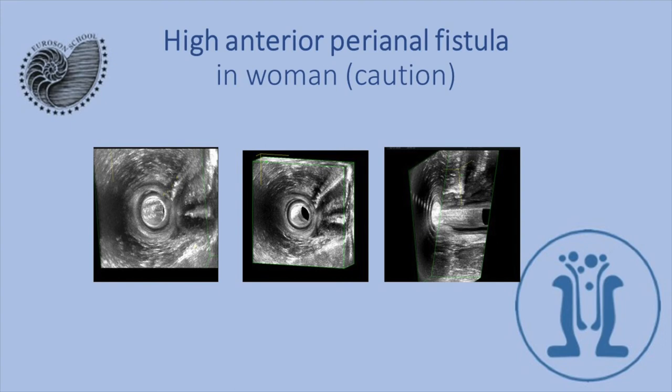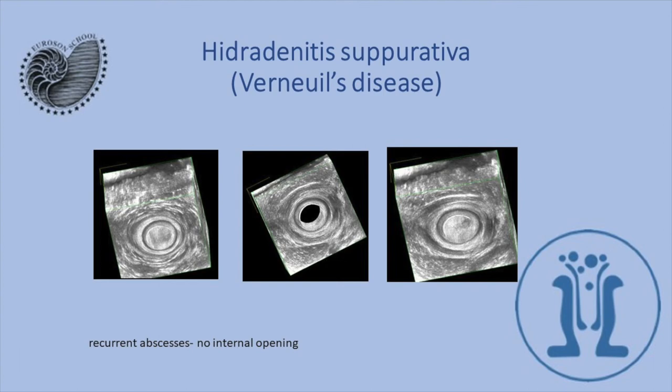Here we have a patient with hidradenitis suppurativa — Verneuil's disease. This is a disease of the skin causing perianal abscesses. Here we see that there is no internal opening; the abscesses are caused by Verneuil's disease itself.